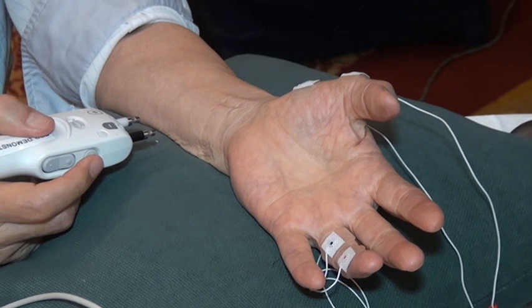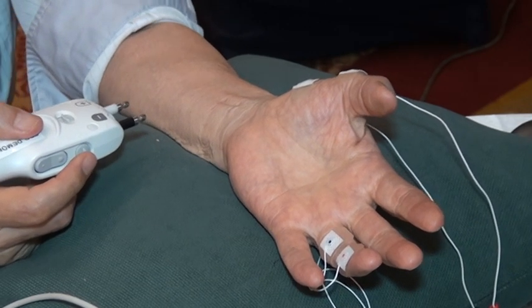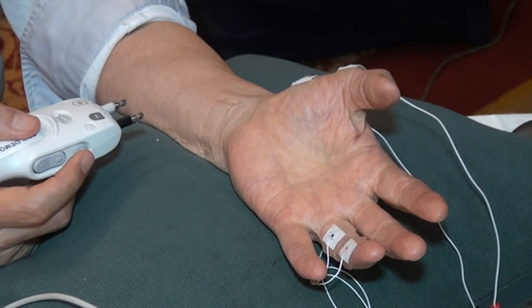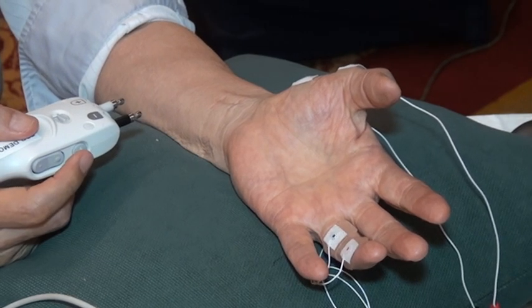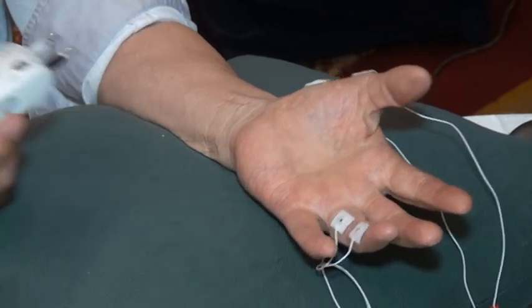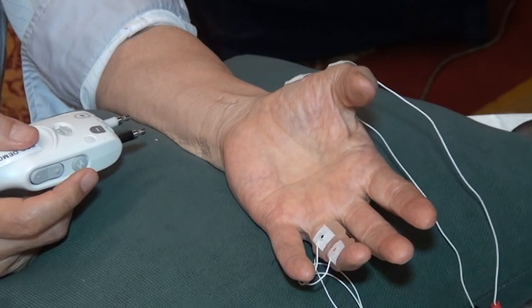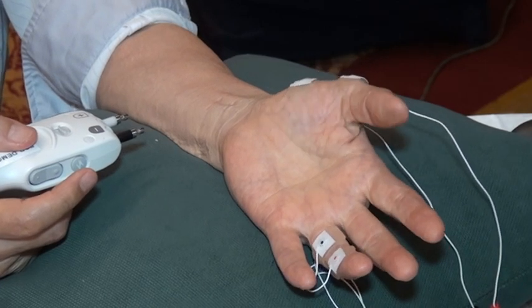Duration becomes smaller. What becomes smaller? Duration. Yeah, duration becomes smaller and amplitude becomes larger. Why is that? I didn't do anything different. You never thought of this kind of thing, right?